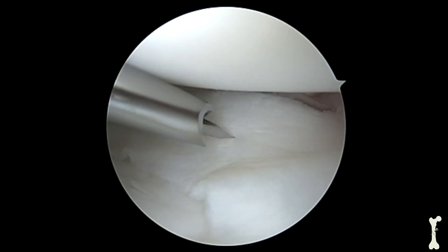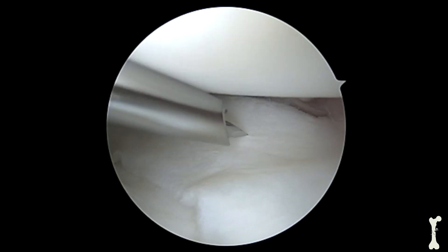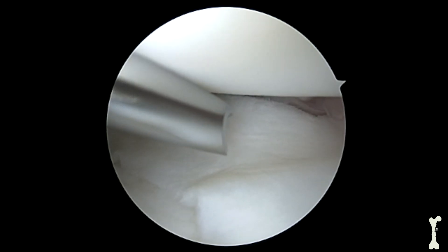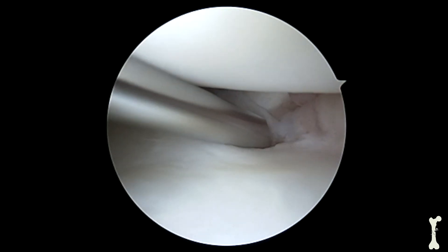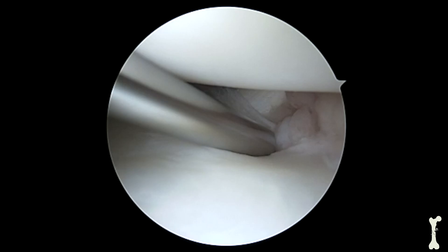Once the meniscus is placed back into the appropriate position, we can begin the repair. Here I'm using my metal cannula to place needles through the meniscus tissue, which will then be used to shuttle the suture.